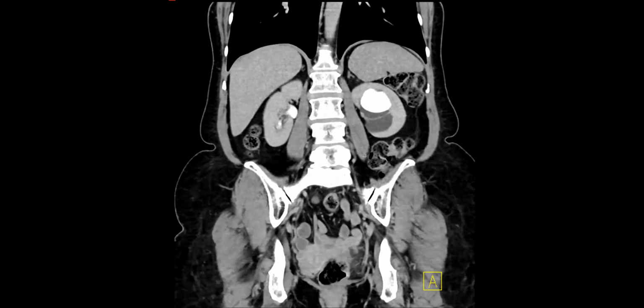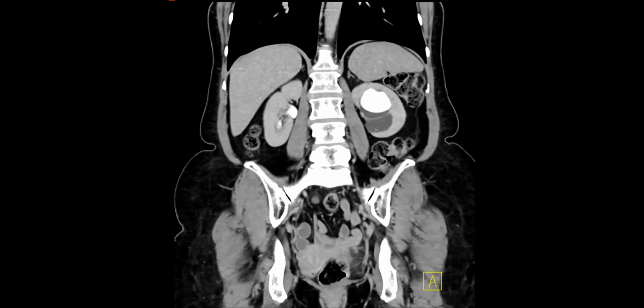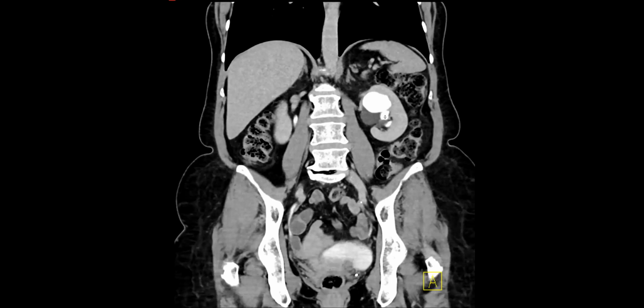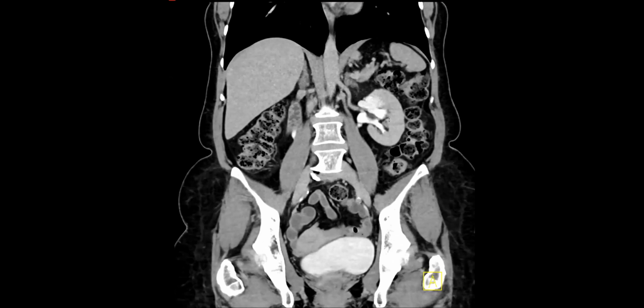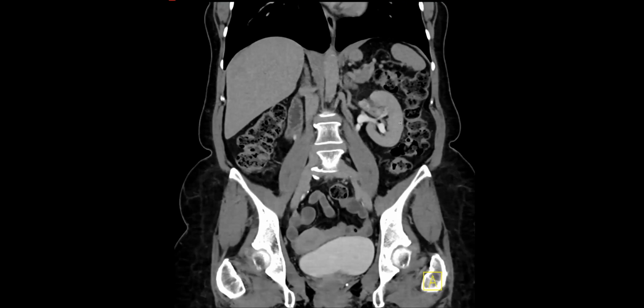And there's cysts, cysts that herniate into the renal pelvis. In addition, there's also a dilated calyx in the upper pole. I feel like you told us a syndrome, like Fraley syndrome. Yes, we did. Yes, exactly.